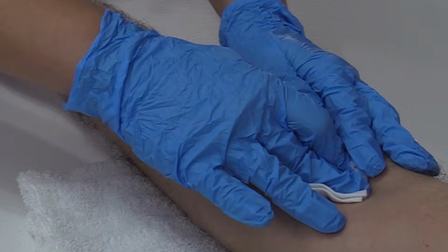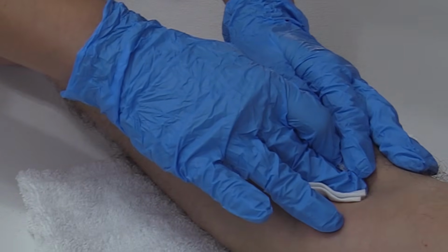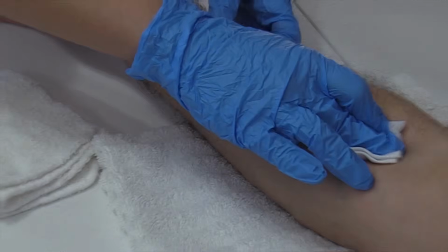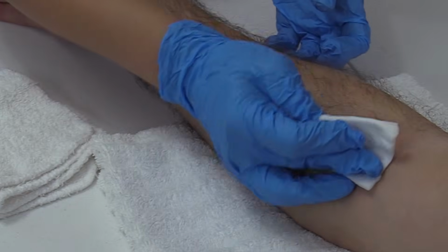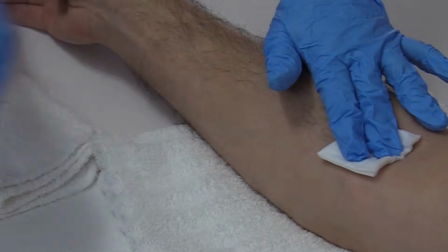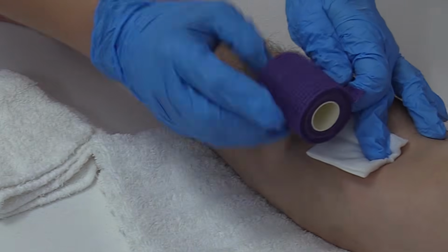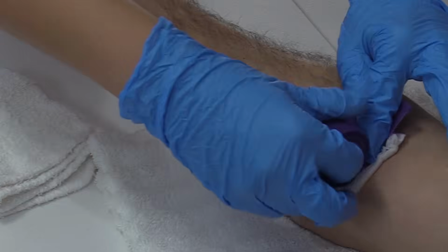You might have to do this for a while if your patient's on anticoagulants. And if your patient is able, you can ask them to do this for you, but it's whatever you prefer. So now I'm going to look at the site and just make sure it's quit bleeding, and it has, but I still want to protect the site. So you can take tape, you can take Coban, whatever the patient prefers. So I'm going to use some Coban to secure it.